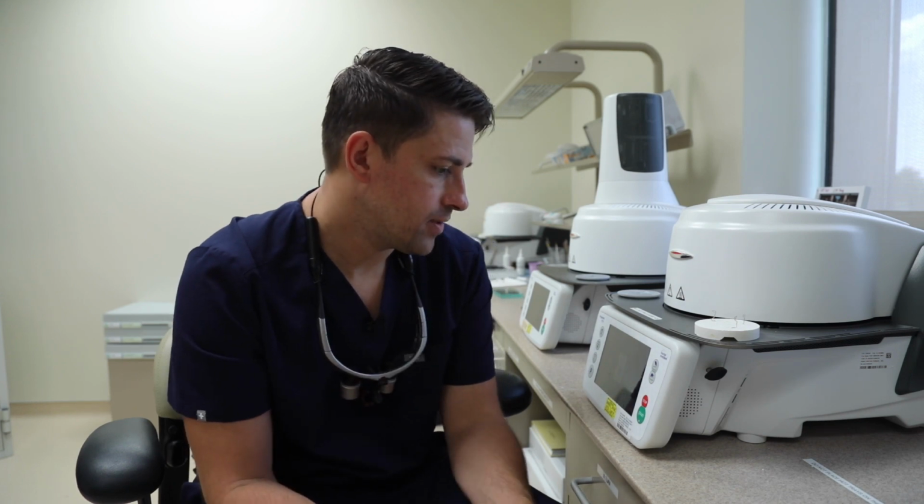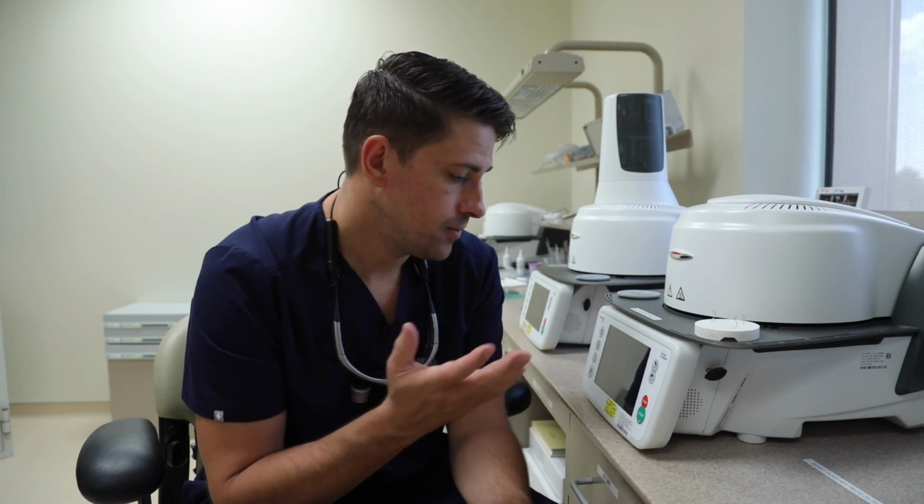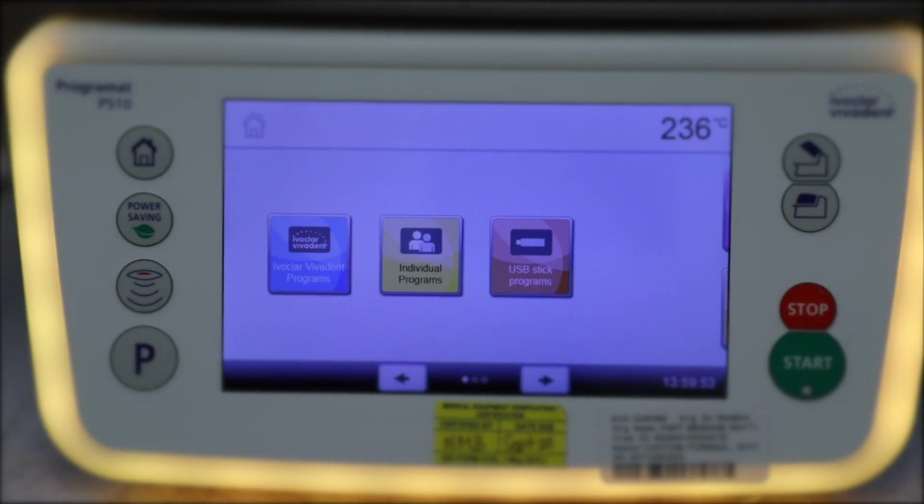All right, so the next step, we're going to actually throw this in the oven. So I got this thing on the crystallization pin, Object Fix, and we've labeled the lingual A3.5. Here we have an Ivoclar Programat P510 oven. You can use any oven really, but let's look at some of the settings that we would normally use when working with e.max.